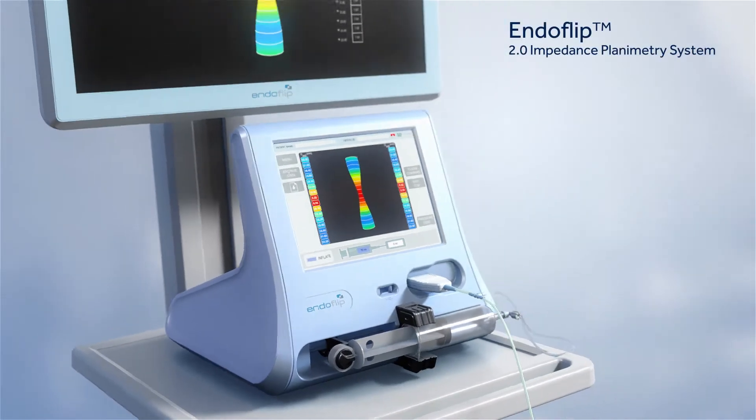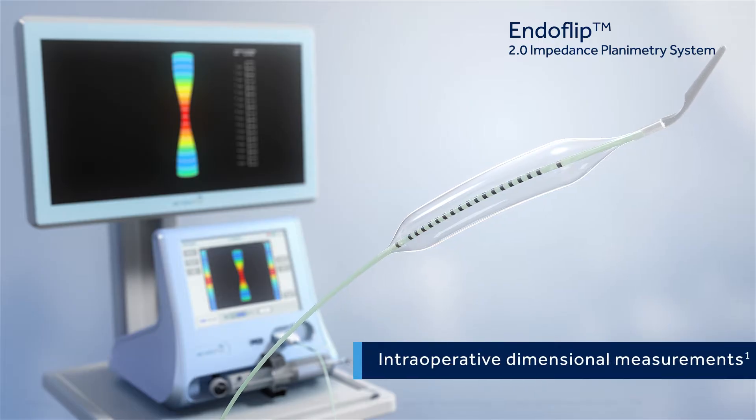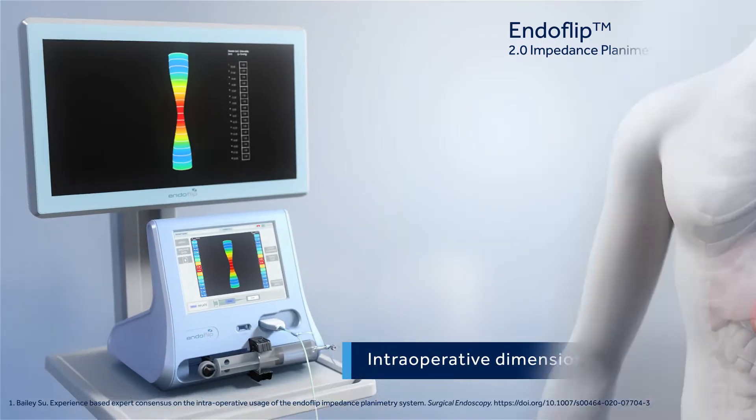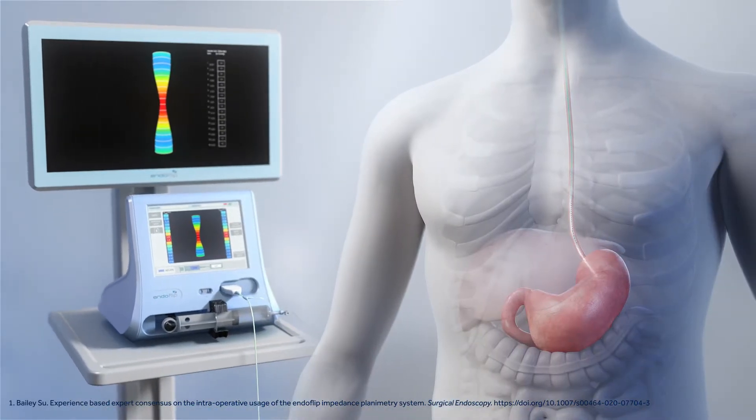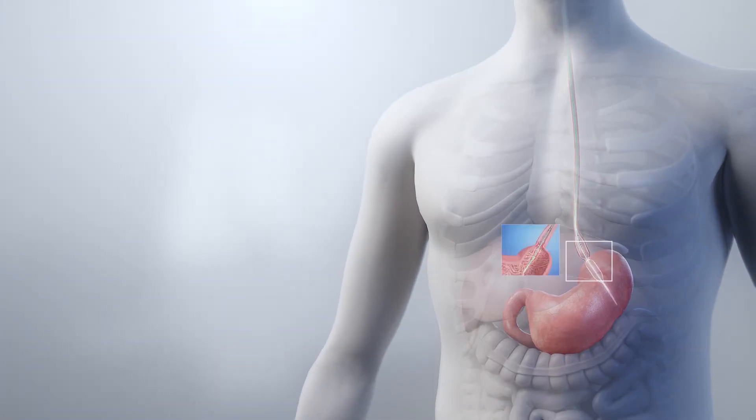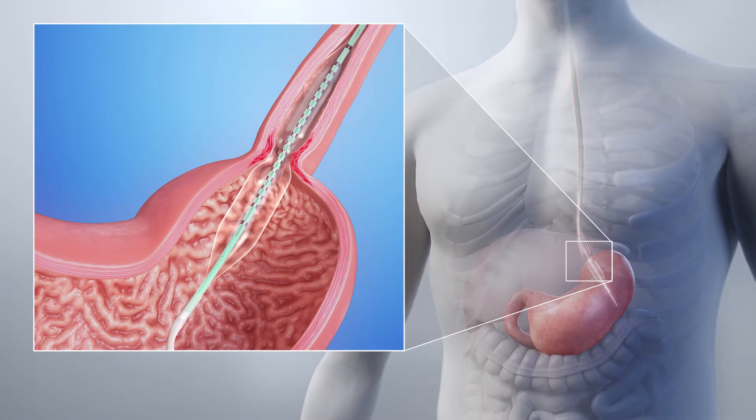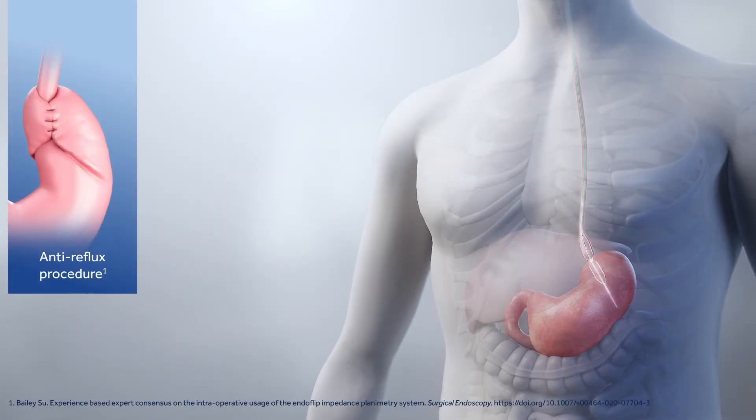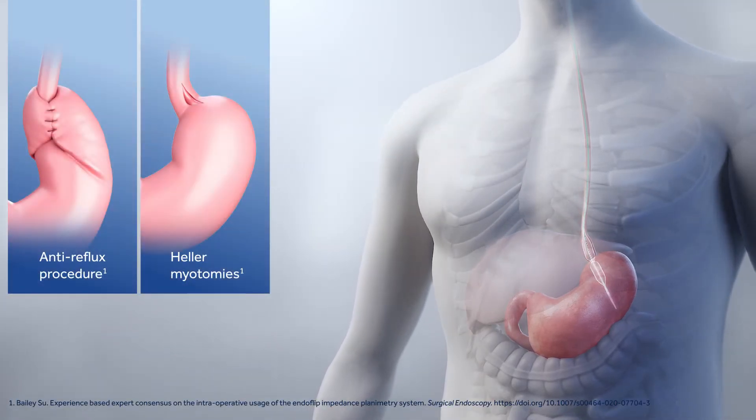The EndoFLIP impedance planimetry system produces intraoperative dimensional measurements that can be used to assess fundoplication and other endoscopic foregut procedures. It provides real-time assessment of the lower esophageal sphincter, which may also aid during anti-reflux procedures, Heller myotomies, and per oral endoscopic myotomies.